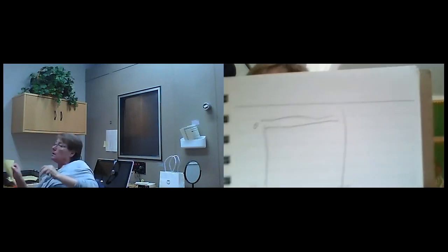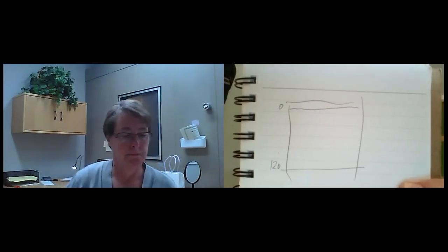So the flat line that you will see at the top of an audiogram, if I draw a picture quickly of an audiogram, you will see 0 here and 120 here. And that 0 line right here is minimal audible pressure. That's why people come in every year to calibrate your audiometer. It's the law. It's just like getting new license plates on your car, or being required to renew your driver's license.